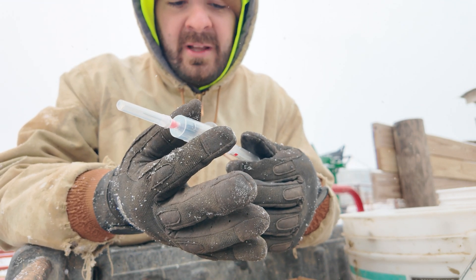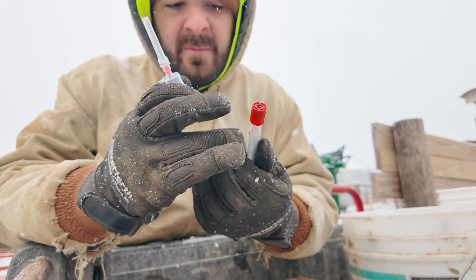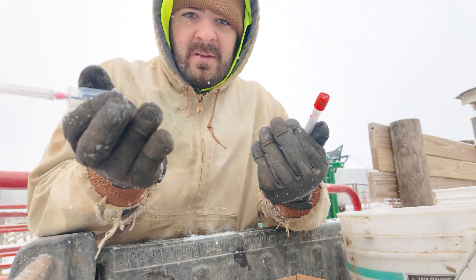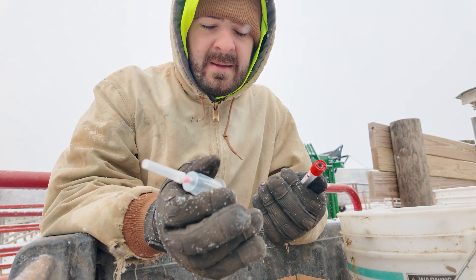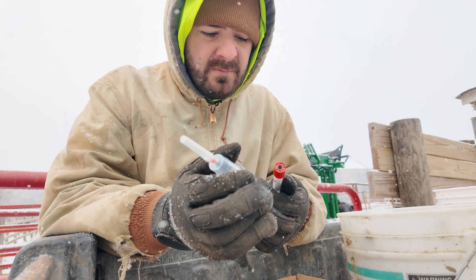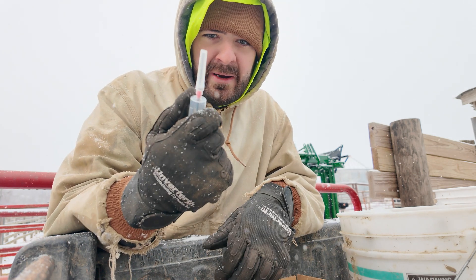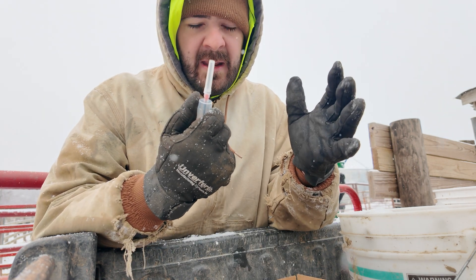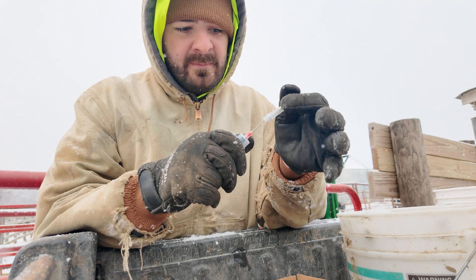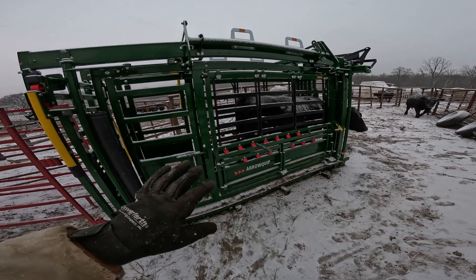That rubber end is meant to pierce the vial. What we're going to do is take this, stick it into the cow's tail at a certain spot — I'll show you that in a second. Once it's in place, we push the tube into the collection cup, and if you did it right, the blood should start collecting into the tube. I usually aim for about two-thirds full. They'll sometimes say to just let the vacuum do its job until it stops, but I've found if you do that, it'll fill completely full.